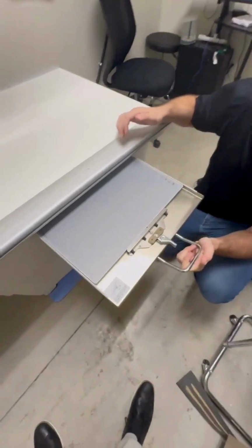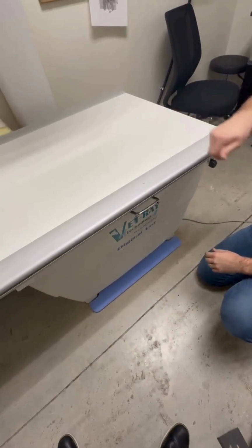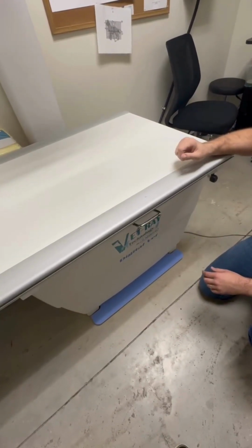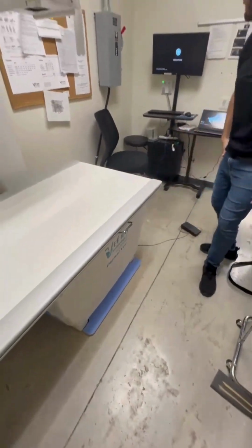Especially with the X-ray, you want to be very careful with your vacuum. You don't want to be aggressive and moving all over the place. That's how you knock wires loose. Just real gentle, get the pet hair out, and you should be good.